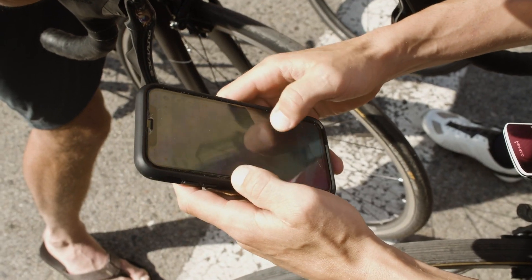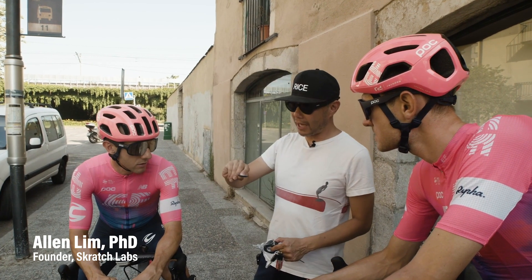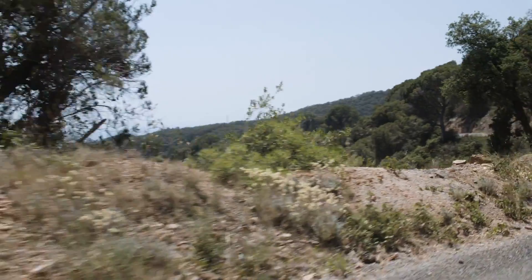We're going to do a little sodium sweat collection today. The way that we do it is with a device called a Macrodut Collector. Essentially it's a plastic disc with a capillary tube inside, and there's a tiny hole with a little bit of food coloring on the backside so you know how filled it is.